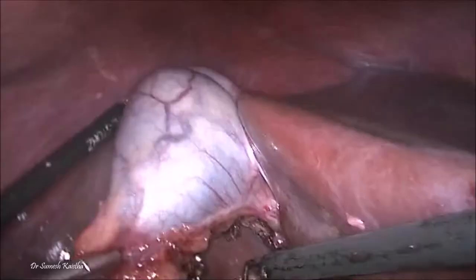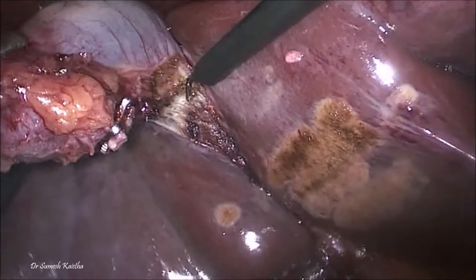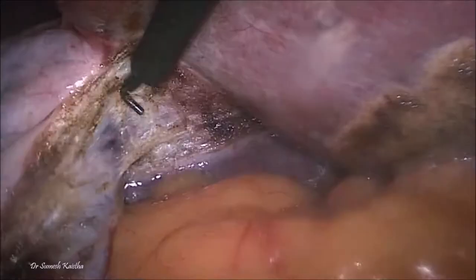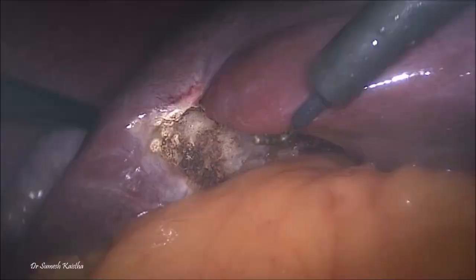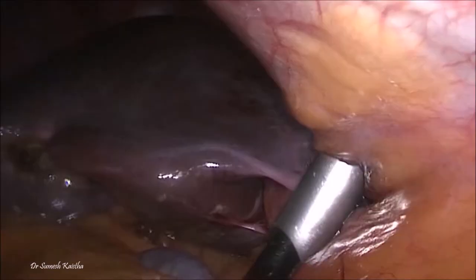A hook is used to achieve separation of the gallbladder from the cystic plate. The gallbladder is removed using a lion's jaw grasper holding the cystic duct end to prevent spillage of bile. A port dilator may be used to facilitate extracorporeal removal.